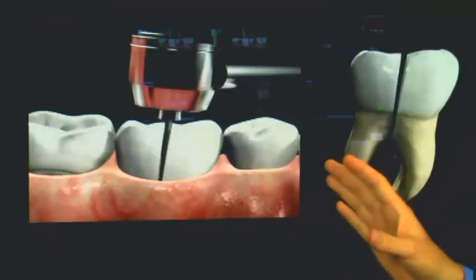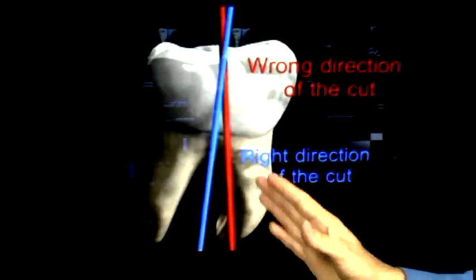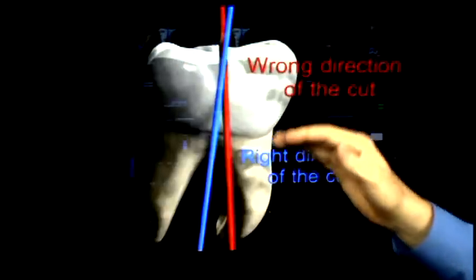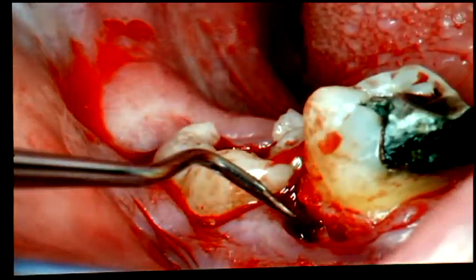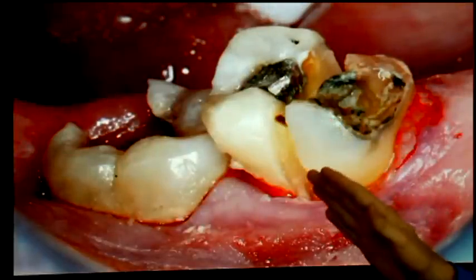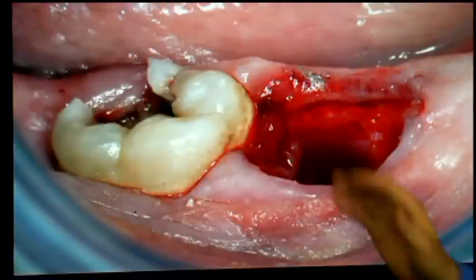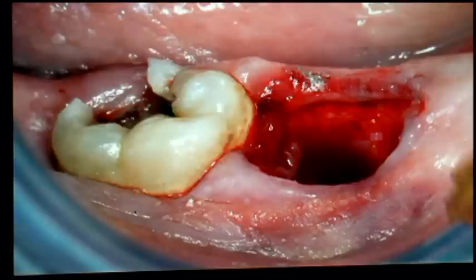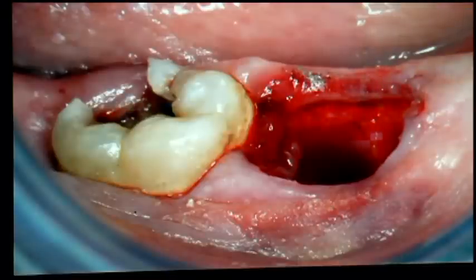The problem is you don't always know where that separation point is. The red line here represents what most people do — going perpendicular to the occlusal surface — which will frequently get you involved in the mesial root. The blue line at a slight angle is what you want to do. The beauty of the physics forceps is that once you pop the tooth loose, you can take an instrument to raise the tooth up in the socket a little bit and make your section perfectly, because now you can see exactly where those roots are. By slightly elevating the tooth before you section it, you'll wind up with a very clean alveolus, without cutting into the bone as you frequently used to do with the old style of sectioning.